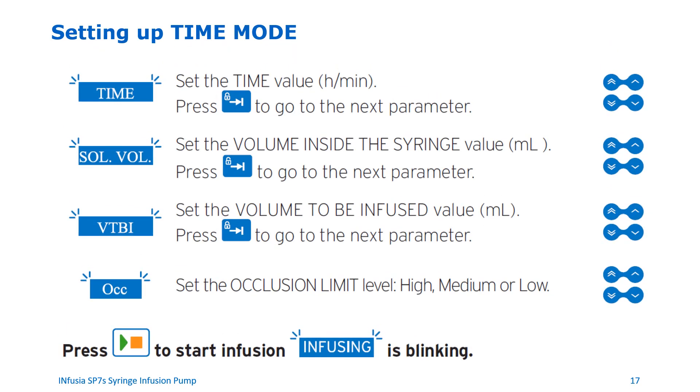Setting up time mode. To set up time mode, follow these steps. First, set the time value in hours and minutes, then press the switch key to go to the next parameter. Set the volume inside the syringe value in mls, then press the switch key to go to the next parameter. Set the volume to be infused value in mls, then press the switch key to go to the next parameter. Set the occlusion limit level to high, medium, or low, then press the OK key to accept the occlusion limit. Once all parameters are set, press the start key to start the infusion. The infusion indicator lights up and the word infusing will start blinking on the screen.